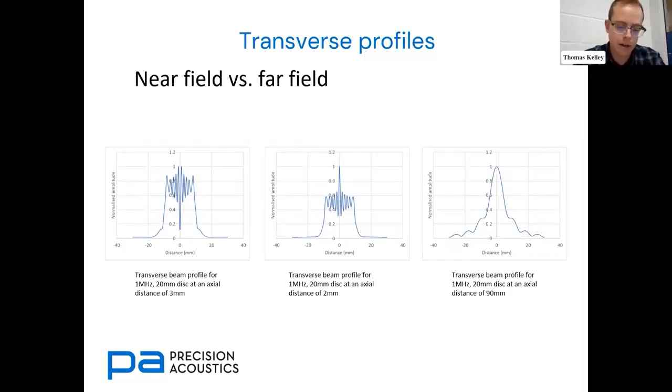In comparison, the far field is much more conventional and obeys the usual sort of formula for a central main lobe with symmetrical side lobes of decreasing amplitude, as you see in a lot of the books.